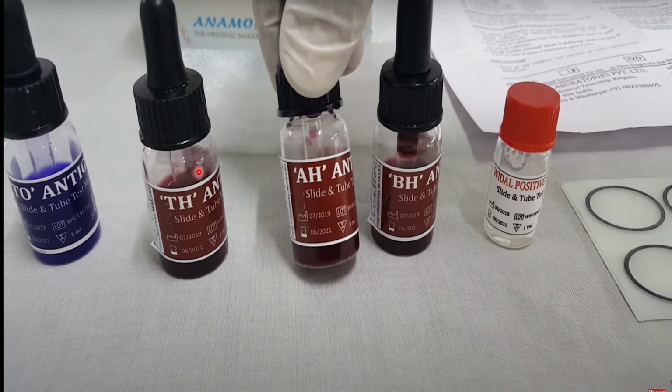So these 4 ready-made antigens, then we have the positive control, and then we will also have one more which is not shown here, that is the negative control.